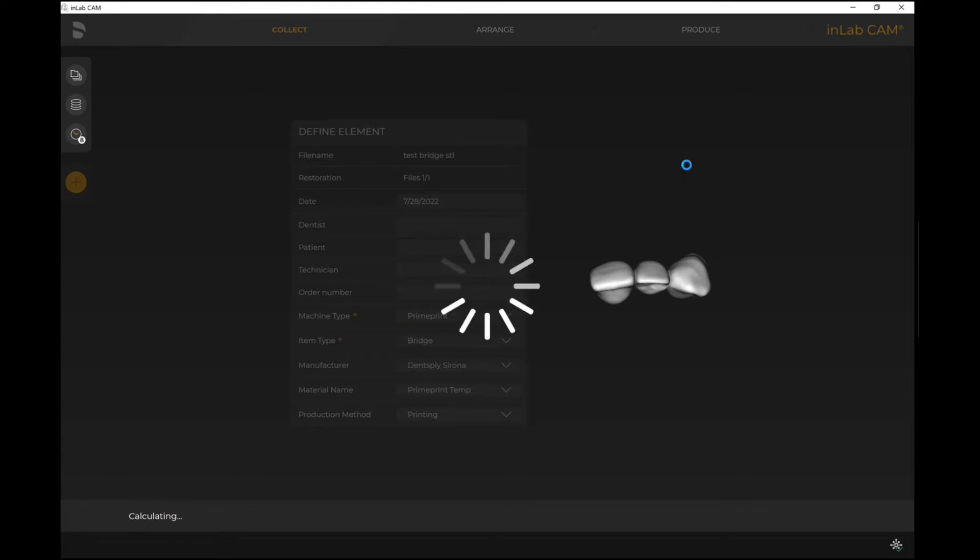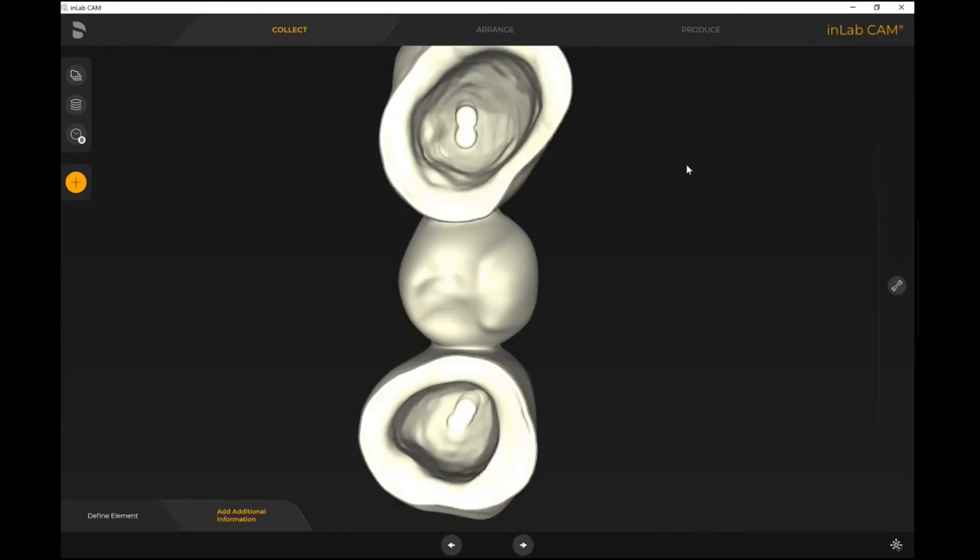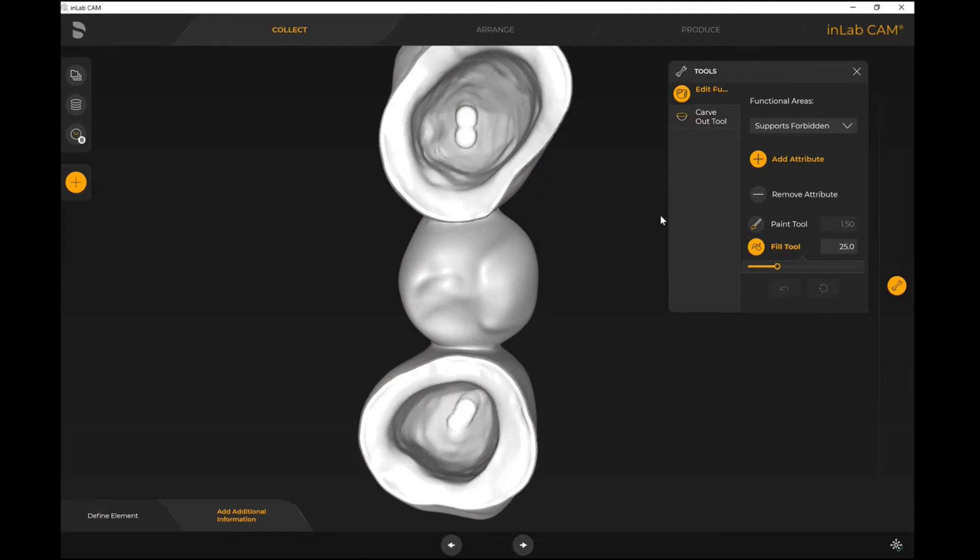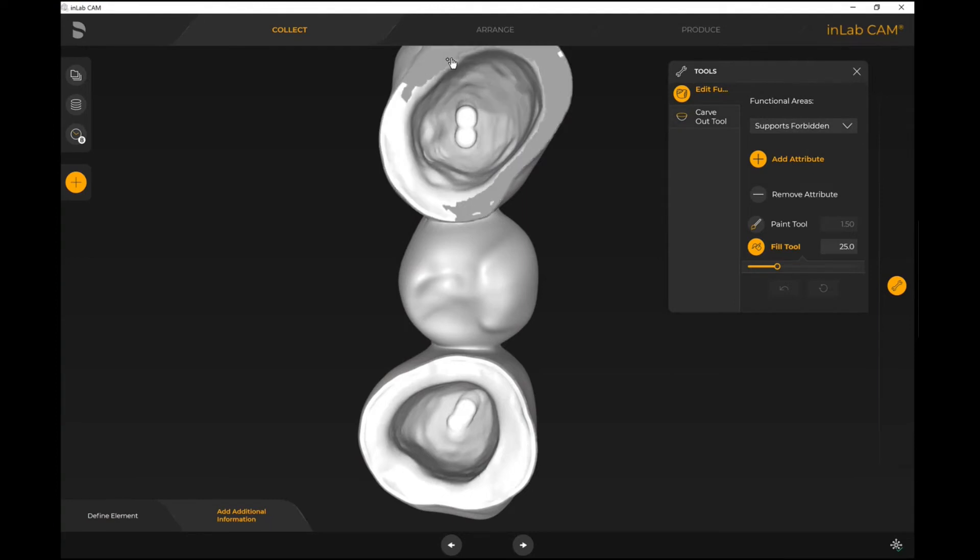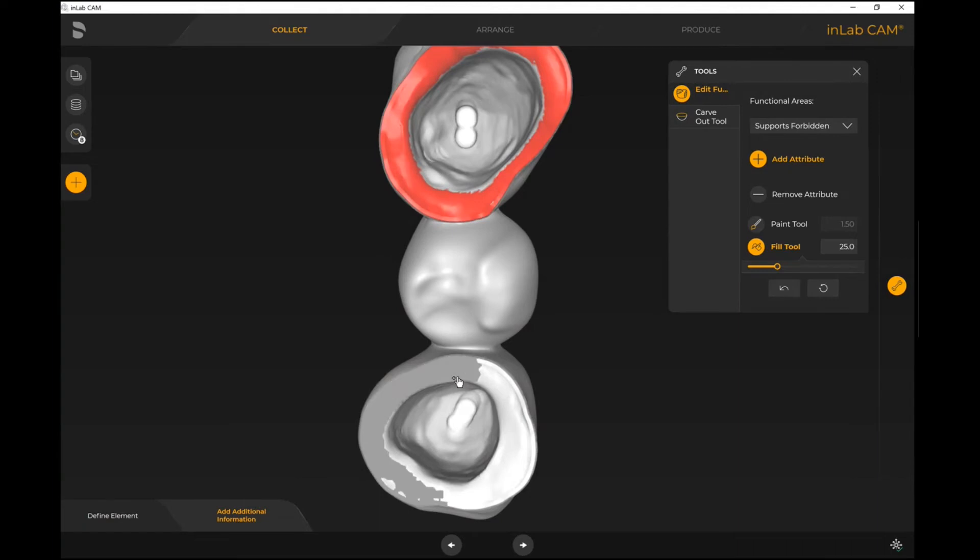When you have an STL file, that is considered raw data, so it's important for the software to know some of those key traits before proceeding forward. At this point in time, I'm able to identify things like my margin if needed. Under the tools, I have the ability to identify some key functional areas. If I want to identify where the supports are forbidden, I can just mark around my margin.